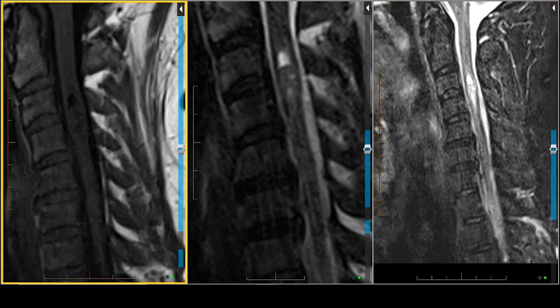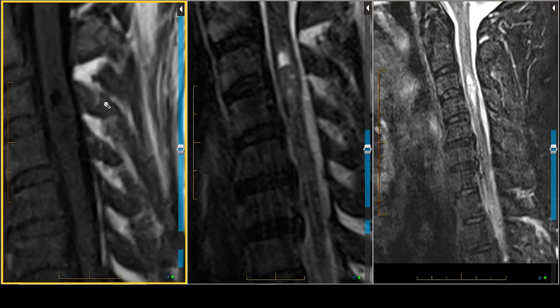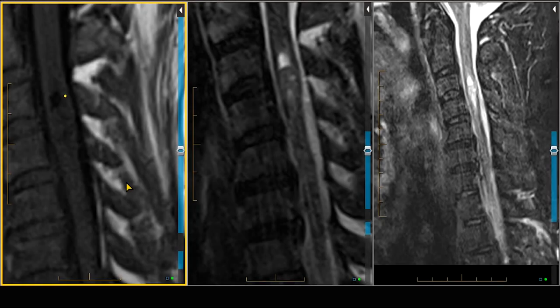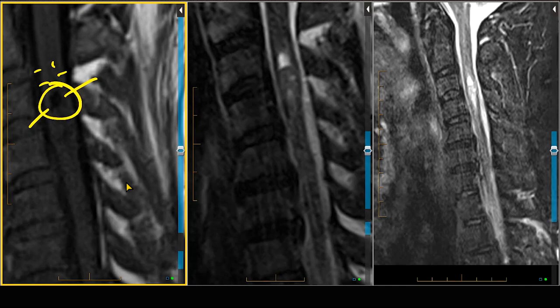Let me just magnify the T1-weighted scan and use my pointer here. This is darker than edema — edema might be up here — but this darker area is what is represented as a more cystic area to this mass.